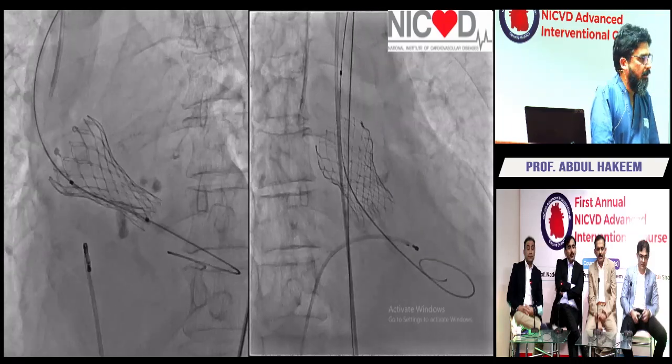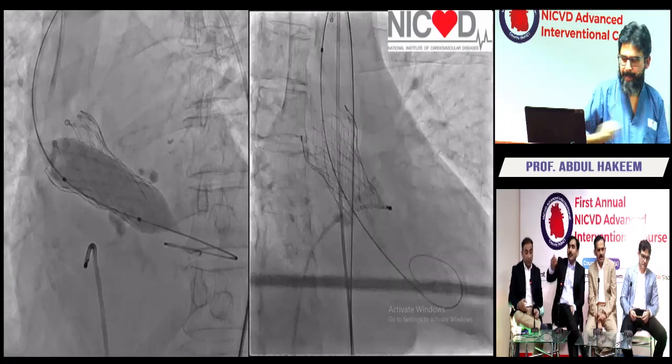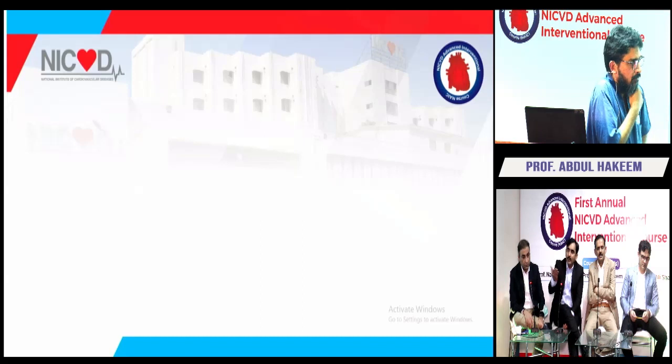Okay. Are there any other points of discussion? So if the patient develops continuous ventricular fibrillation after the embolization and putting a second valve, snaring is the option. You just snare it out and give the space to the cusp. Okay, let's just say that you just can't snare this because you've put a 29 now and you've post-dilated it, and it's so hard you broke the snare. What are you going to do now?